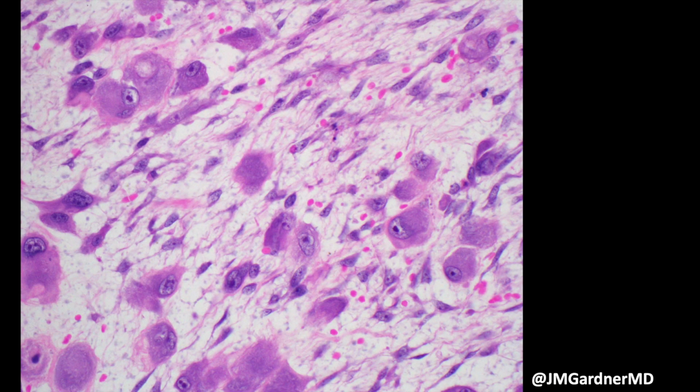Now, what about these wild-looking cells? So these big cells are kind of the one exception to the rule. They're kind of atypical, if you like that terminology, and you can see them in the setting of a background that looks like nodular fasciitis. We've got this loose kind of myxoidy background with extravasated red cells, which some people find very helpful for fasciitis. And we've got these spindle and stellate myofibroblasts, but then we've got these big, huge ganglion-looking cells here.